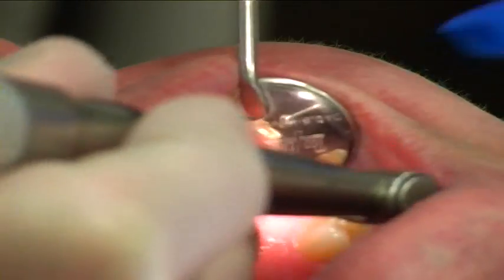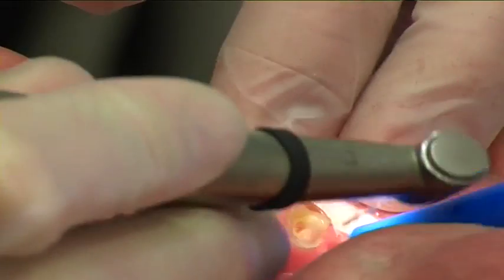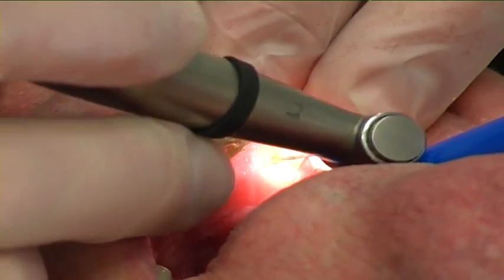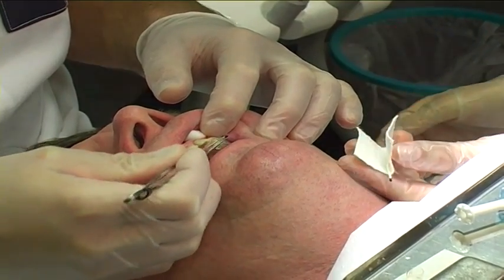The temporary filling was removed. Two-thirds of the length of the gutta-percha root canal filling was removed using a Largo burr. Gates Glidden burr can also be used. The canal was rinsed with saline and dried carefully using paper points.